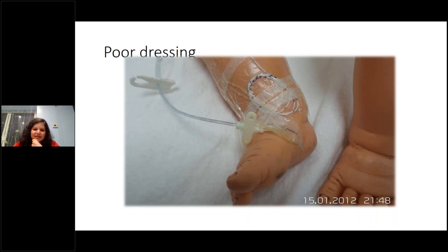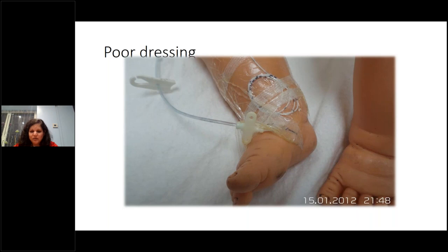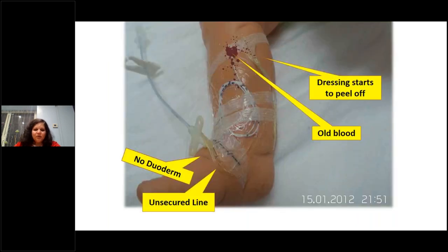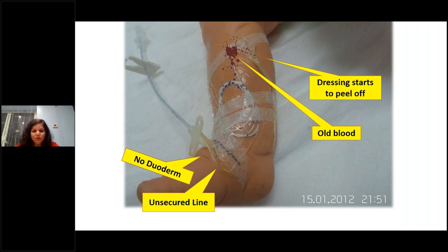This is an example of a poor dressing — the hub is coming off, not underneath the tegaderm, there is nothing underneath, no duoderm, and the line isn't secured. This can cause pressure sores in a preterm baby with delicate skin, and when you try to remove the dressing you risk losing the line. Make sure you dress properly on the first instance. Where you form the loop is also equally important.